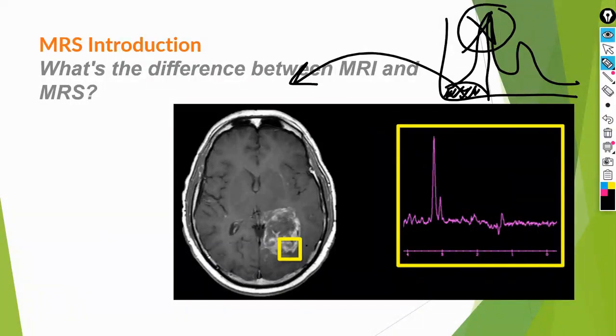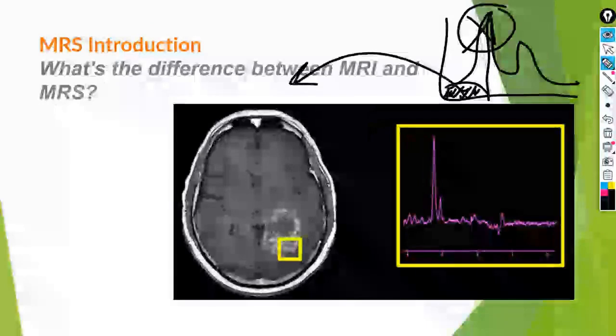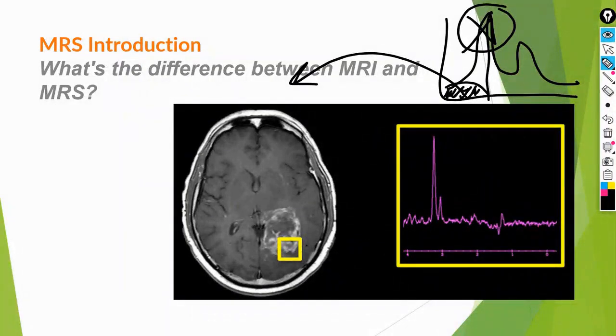What do you do when I give it an RF pulse? Remember the saturation topic I was talking about. I was saying that I can apply a saturation pulse to eliminate the hydrogen present in water. In this case, I can start the MRI spectroscopy sequence, focusing now on the metabolites. This is very important. I will get a spectrum that looks like this.